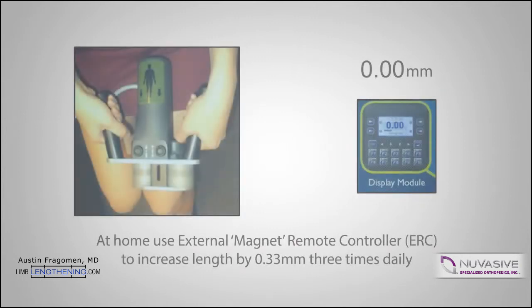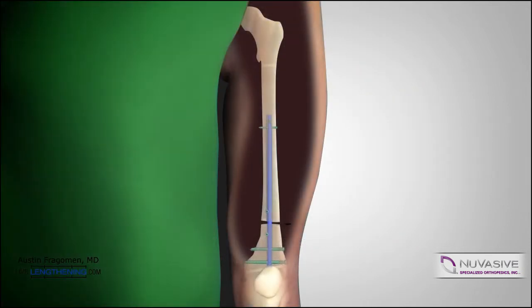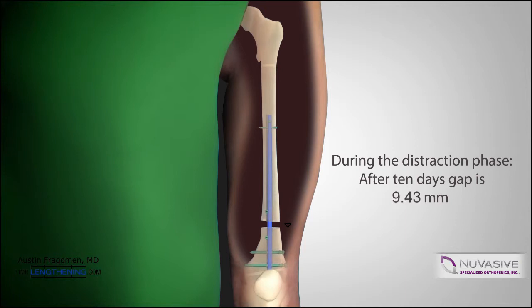Postoperatively, the patient starts the lengthening process four days after surgery. The lengthening is performed at 0.33 millimeters three times per day, giving approximately one millimeter of length per day. Therefore, after 10 days of distraction, roughly 10 millimeters is achieved.